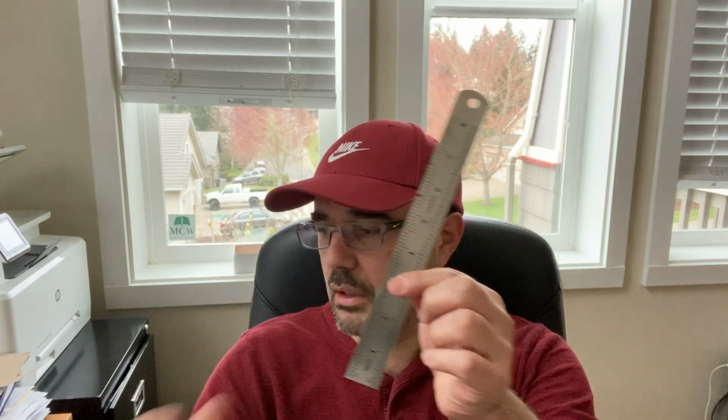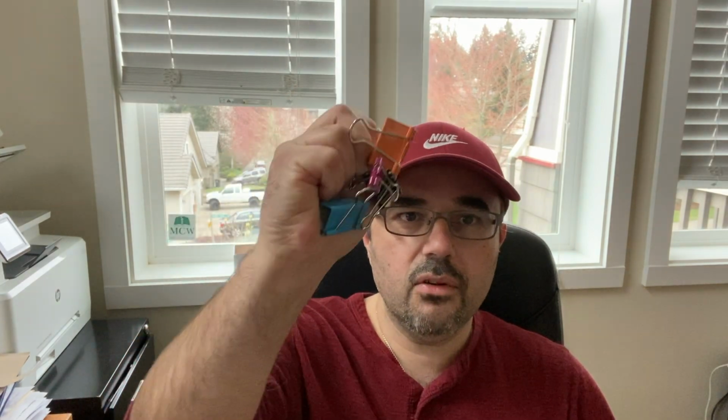But in addition to your filter, you're going to need a ruler, and some heavy duty shears or scissors. I recommend a bunch of these binder clips, at least 3 of them. You'll need a marking pen or a Sharpie, and then a glue gun. So once you've gotten those items, I'll pause for a minute.